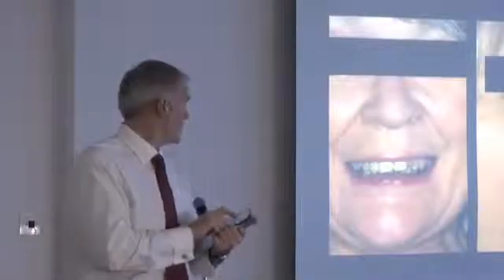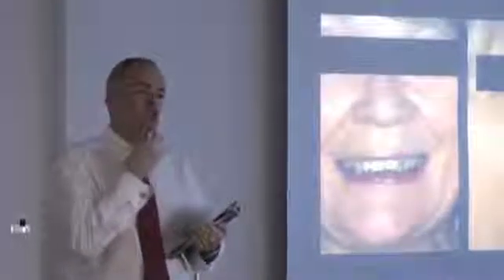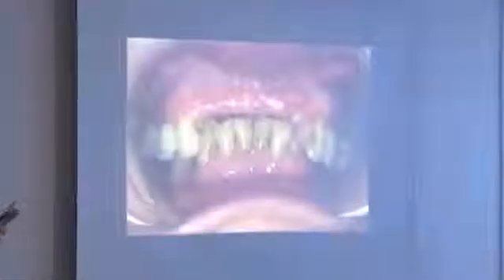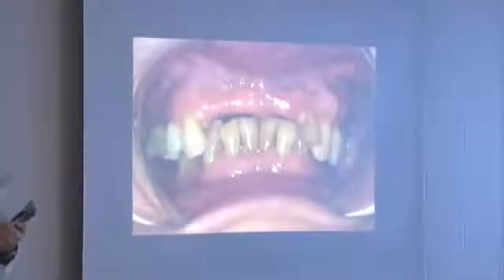I'll take an example to show you really where you can take this to. This lady here, class 2, we can't turn her into class 1. She's got micrognathy. Her lower jaw is so much smaller than her upper. Here it doesn't look so bad, but the true reality becomes exposed there, where all her lower teeth are sitting inside her uppers. Her problem was that every tooth in her upper jaw was sore. And she blamed the partial denture, because it was the usual: I got a denture, then I lost another tooth, then I lost another tooth. It must be the denture's problem.